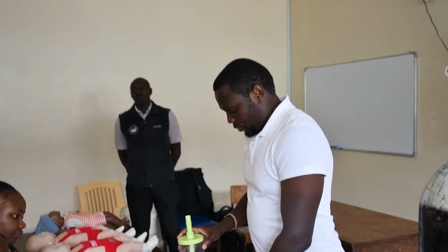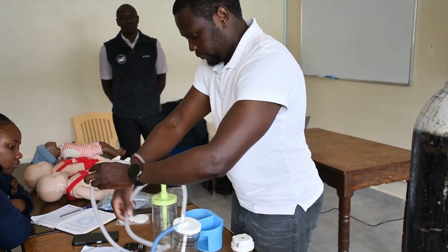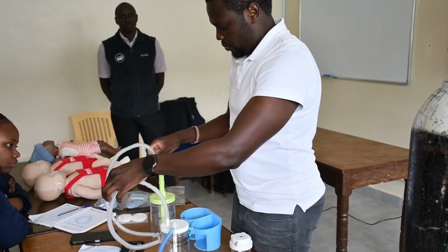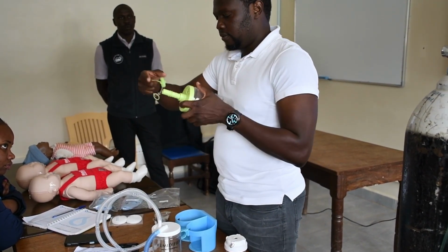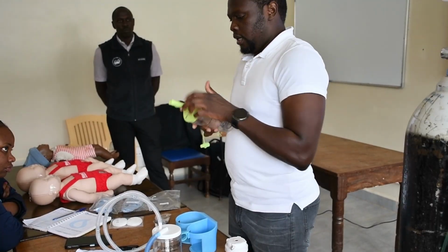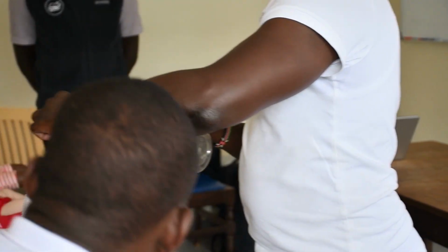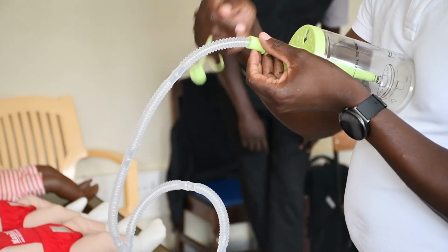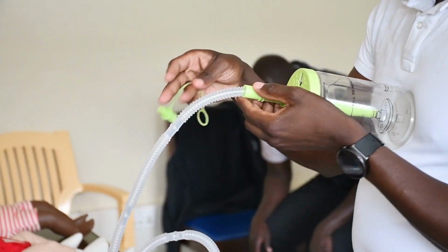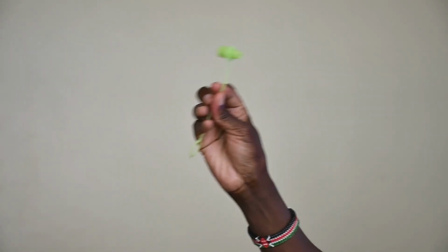So that comes to the other end, and now you have the other tube. On this end, this tubing cannot go directly in. So that's why you have this. It's called the pressure generator connector.